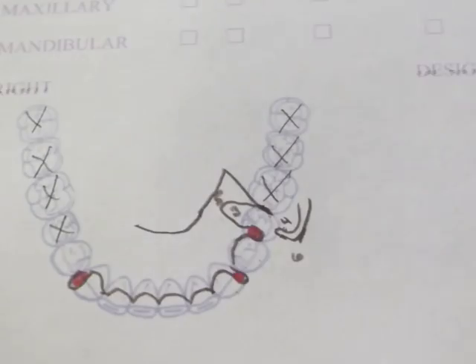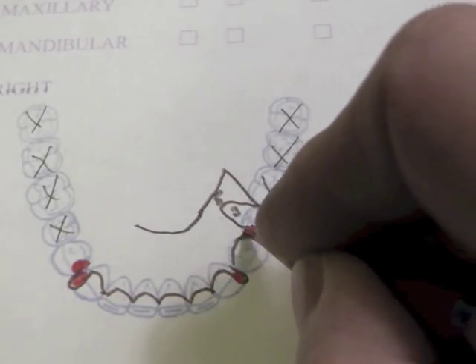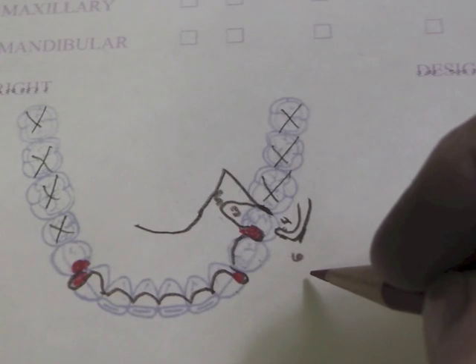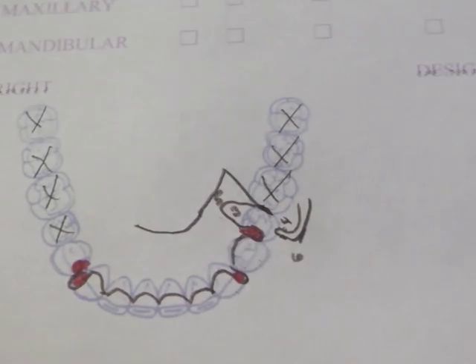On this other side we're going to do an I-bar also. We're going to have a rest here, and that rest will have a little bit of a sluiceway in it — same way over here — because this metal has to come up and over the cusp. We're not bringing an arm through the front of that tooth or the buccal, therefore we do not need to have a sluiceway coming forward.